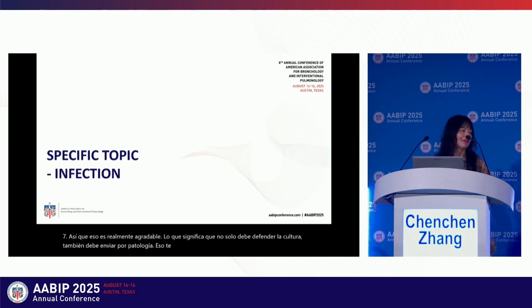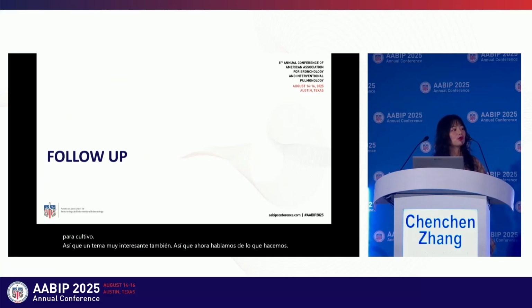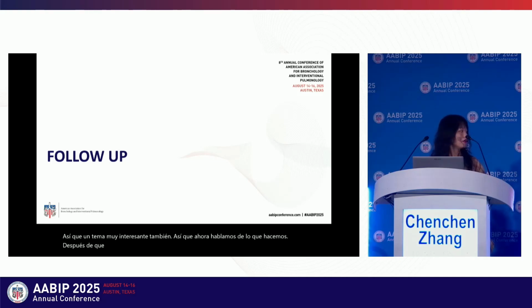I believe we do that anyways. And so for mycobacteria, obviously, we definitely need to send that for culture. So very interesting topic as well. So now we talked about what we do after we do the biopsy.